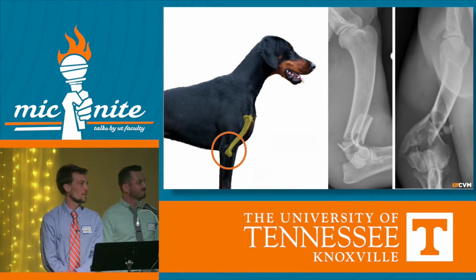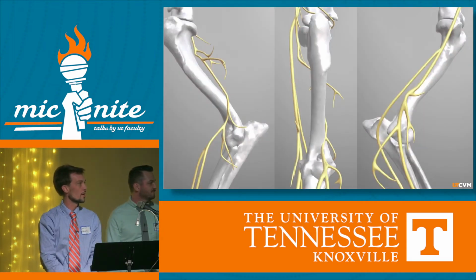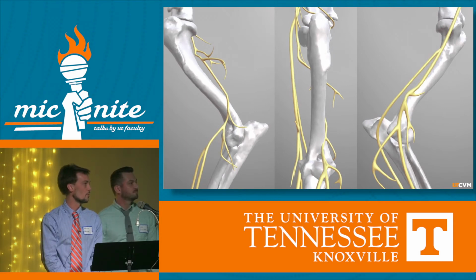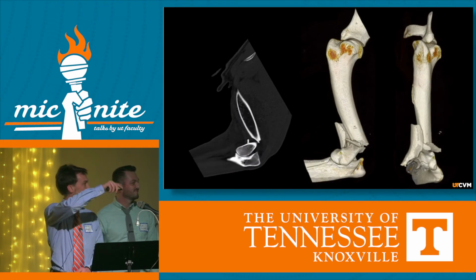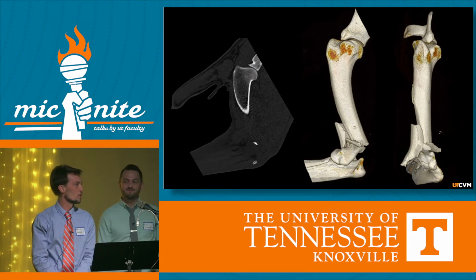So it's already a complicated fracture to repair, but you need to be aware that along your arm, you have plenty of nerves which are each associated with an artery and vein. So if you go in surgery and you transect any of those, you're not going to regain full function of your limb. So the best way to fully evaluate the amplitude of the fracture is to put the dog in CT again. So on the left side of the screen, you're going to see a CT the way we see it as radiologists, black and white pictures. That's the elbow joint, that's the broken bone, that's the shoulder joint, and we get this data, put it into the computer again, and get a 3D model which is much more explicit.